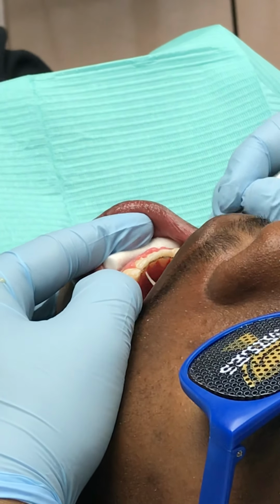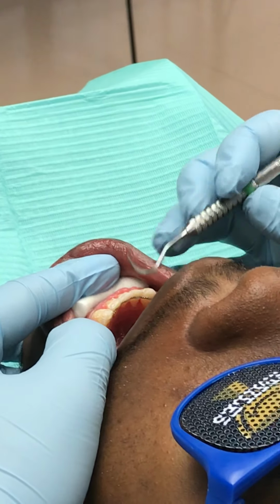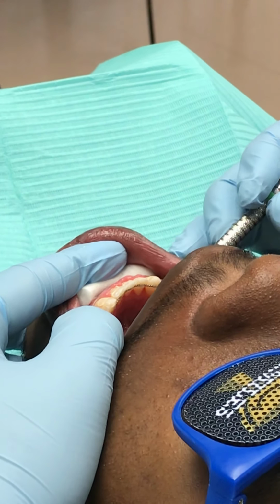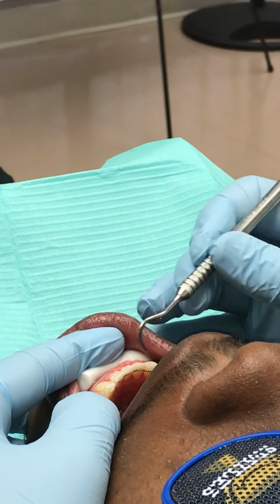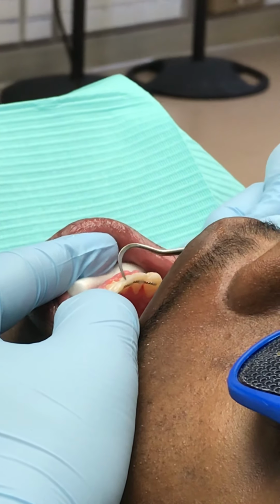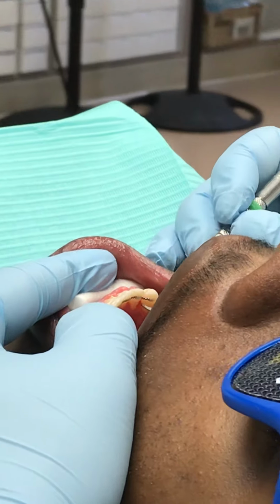Also, we didn't talk about placement of the wire much. That's because you can refer to the guidebook for a figure to describe placement, but briefly, just like we don't want the adhesive close to the gum tissue, we also don't want the wire close to the gum tissue. We want the patient to be able to floss properly. If they can't floss properly, this retainer isn't going to do much good because it's never going to last. So we keep the wire as far away from the gum tissue as we can without the wire going vertically above the embrasures in between the teeth. We don't want anybody to be able to see the wire in between the teeth from the facial. So you can see that the wire is basically right at the level of the contacts, just below the embrasures, and a good distance away from the gingival surfaces.